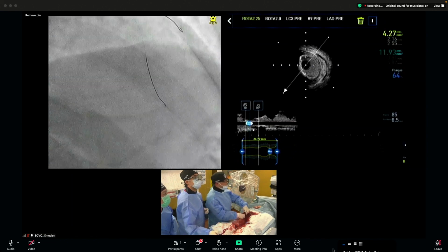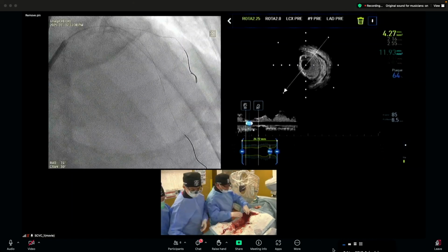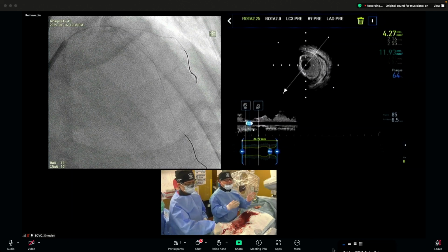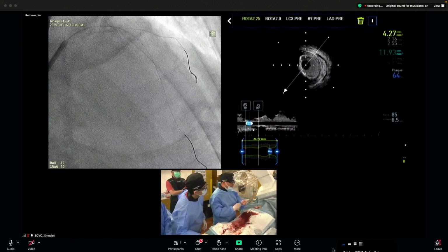Volume reduction means reducing the calcification mass, and of course compliance changes much. It's an important point. Additional cracking also gives much better compliance of the vessel, but sometimes it's not enough. So I choose volume reduction and the cracking technique.